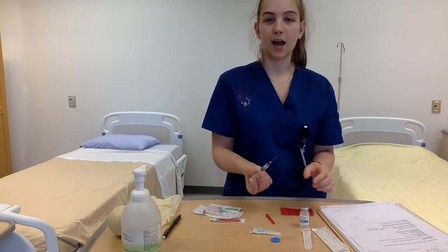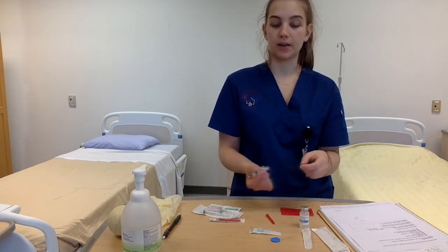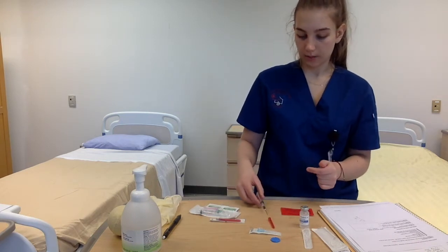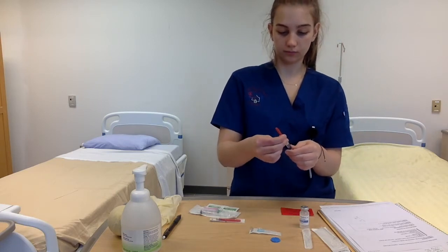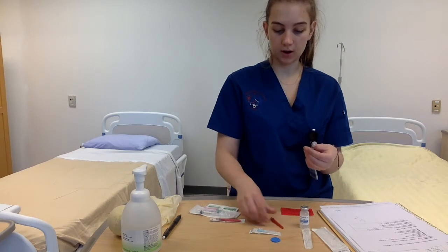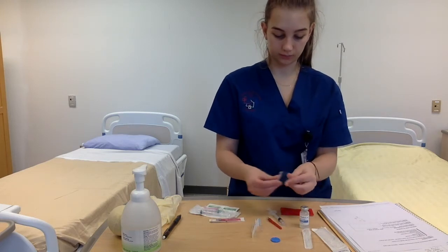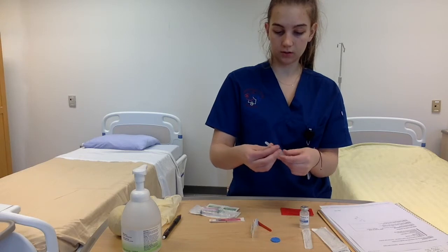And then I'm going to have to switch the blunt tip needle to the needle that we're going to be giving to the patient. So it's really important to be careful when we're switching the needles. Okay, so I just take that one off, and then I set up the subcutaneous needle and just twist that one onto the syringe.